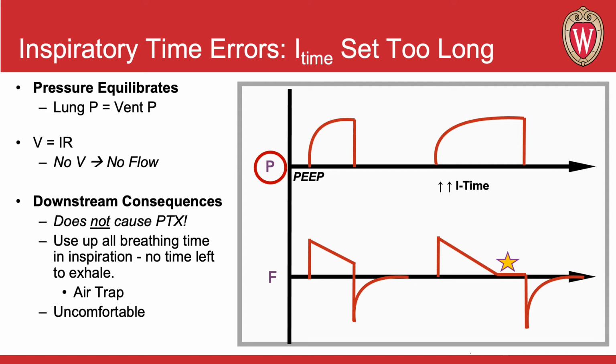And you get this funny thing called an inspiratory pause, which I've shown with the star here, where the vent is still giving positive pressure, administering it, but there's no airflow happening. So if you do this, it sounds like this. Where you pause at the end of inspiration.